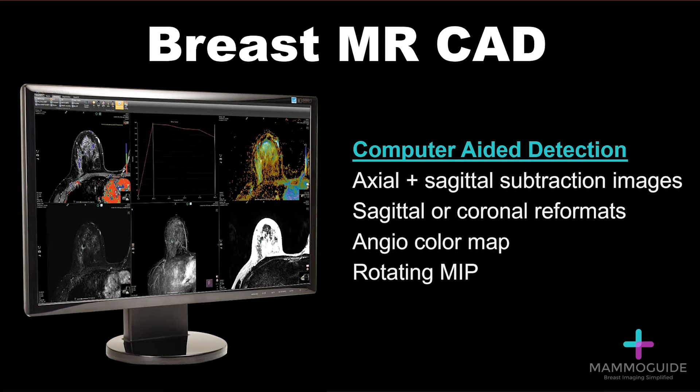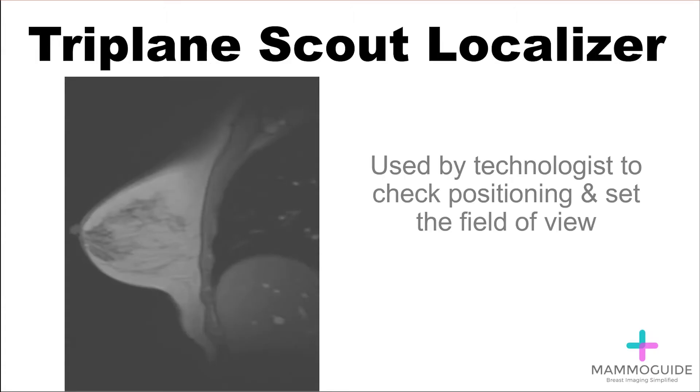This software allows for creation of axial and sagittal subtraction images, coronal or sagittal or any other plane reformats, color mapping and evaluation of kinetics, and rotating MIP, or maximum intensity projection images. Let's go through the sequences one by one.